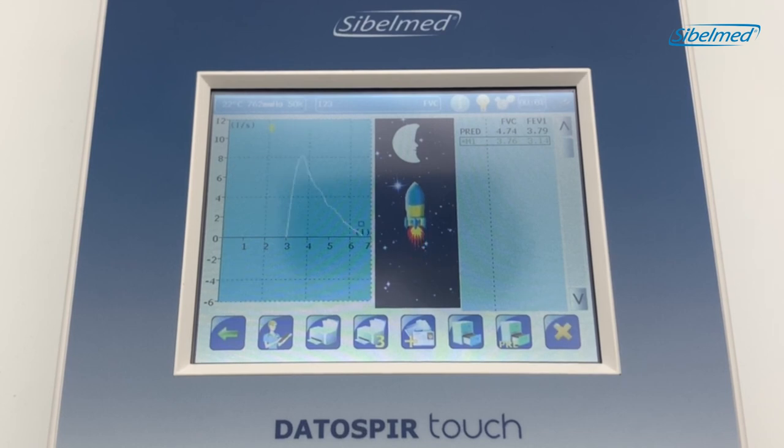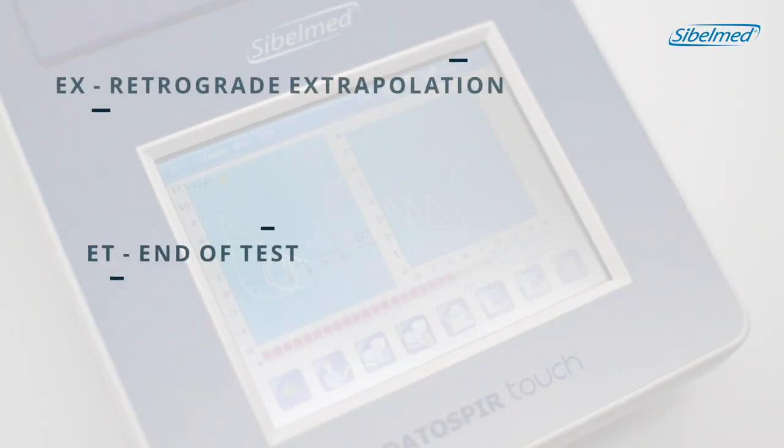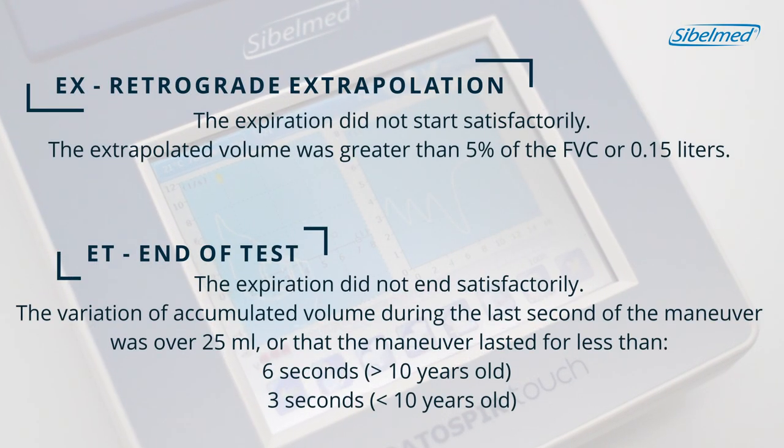Let's perform a second maneuver. We can exhale directly on the transducer without the tidal volume. Let's perform the third maneuver. A flashing arrow shows that the maneuver is in progress. We will click on the cancel icon whenever we need to stop the maneuver. At the end of the maneuver, some warnings such as EX or ET may appear if the quality criteria are not being met.